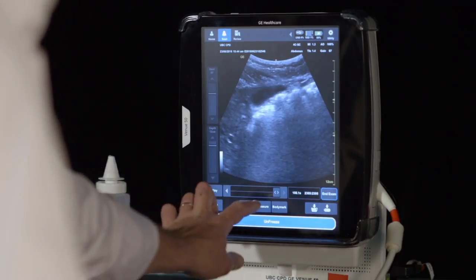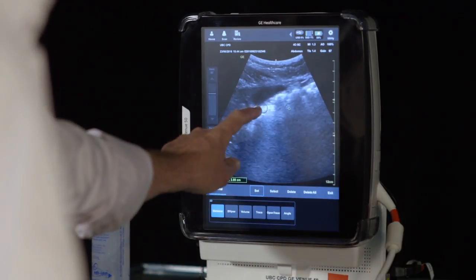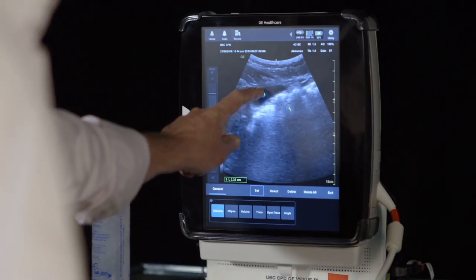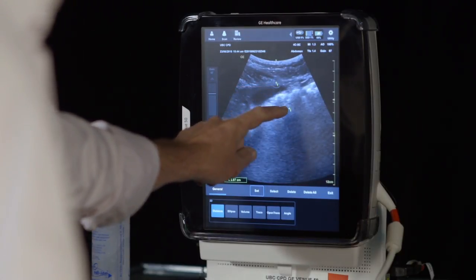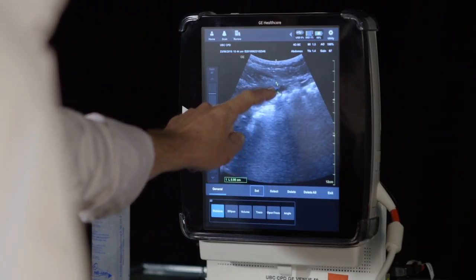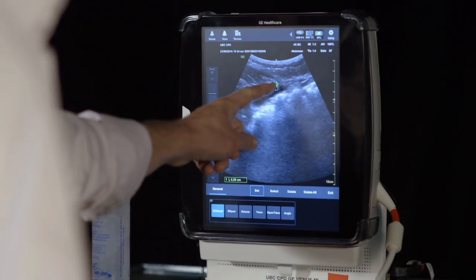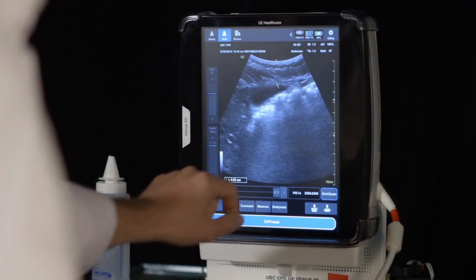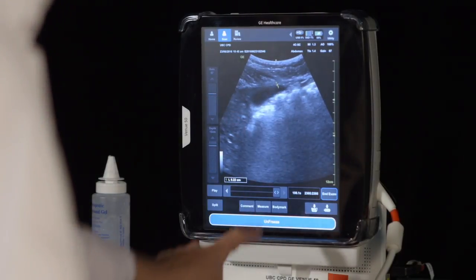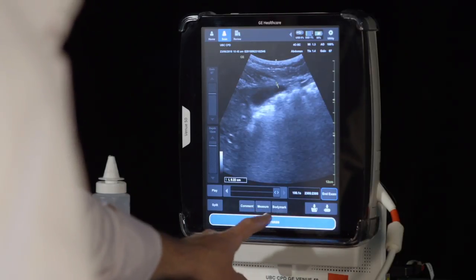Next, measure the gallbladder wall thickness. You must do so on the anterior wall of the gallbladder, which is the area nearest the top of the screen. This is best seen in the transverse or short axis orientation. Remember that this means transverse to the gallbladder and will not necessarily be transverse to the patient.